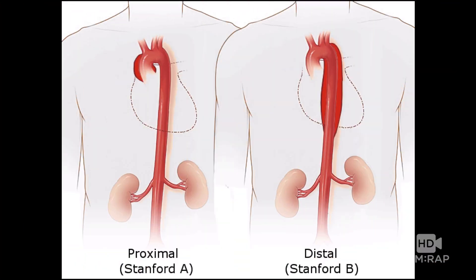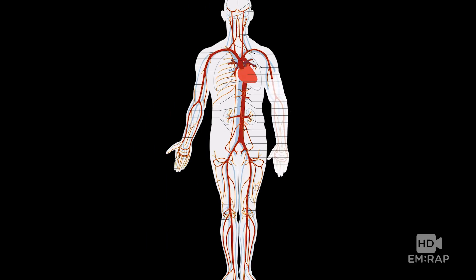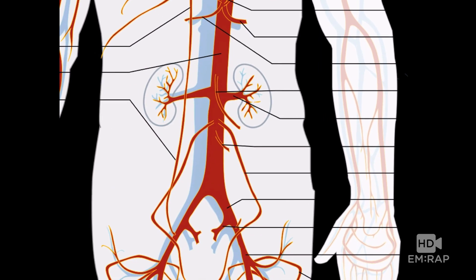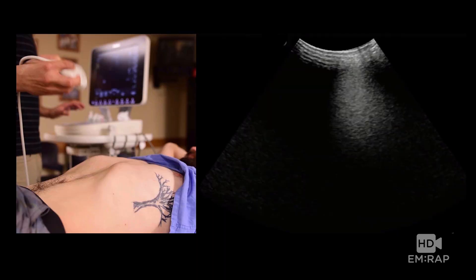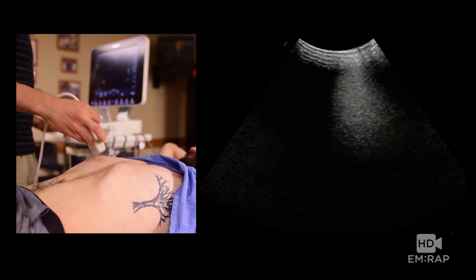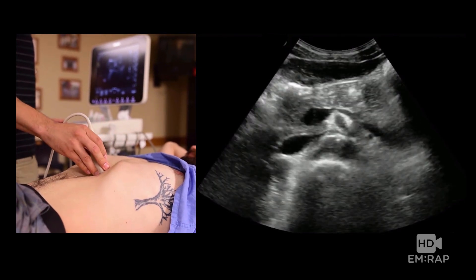There are two ways you can classify dissections: proximal or distal. We're going to talk about looking for a distal type B dissection first, because the abdominal aorta is probably the easiest part of the aorta to visualize. You're going to use your transducer, place the probe marker over towards the patient's right, and start right in the epigastric area.